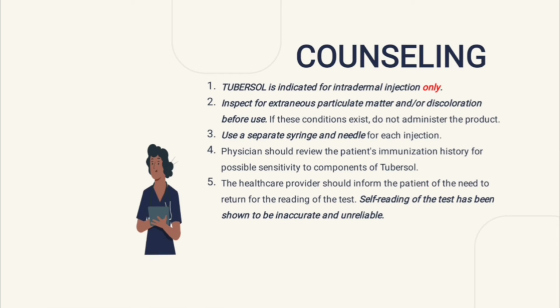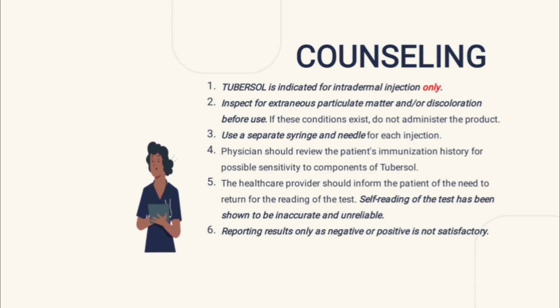Number 5, the healthcare provider should inform the patient of the need to return for the reading of the test. Self-reading or self-interpreting of the tests has been shown to be inaccurate and really unreliable. Not all persons have the medical knowledge to interpret a result. Number 6, reporting results only as negative or positive is not satisfactory. Remember.